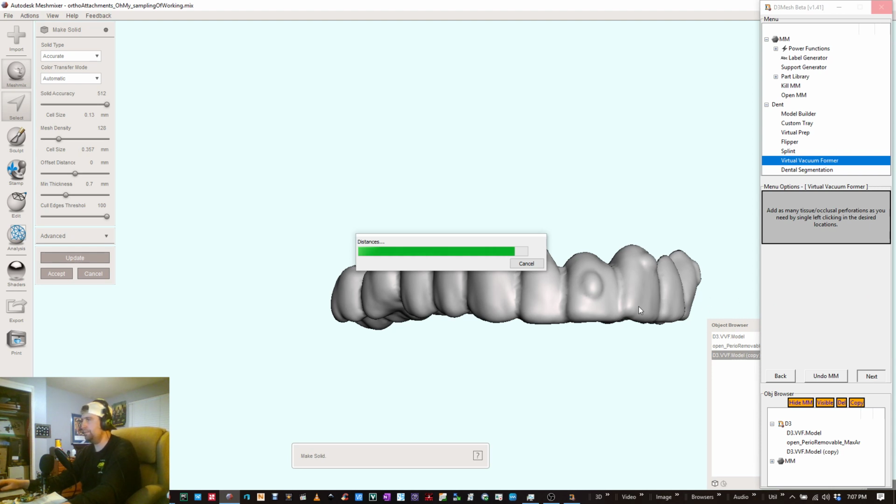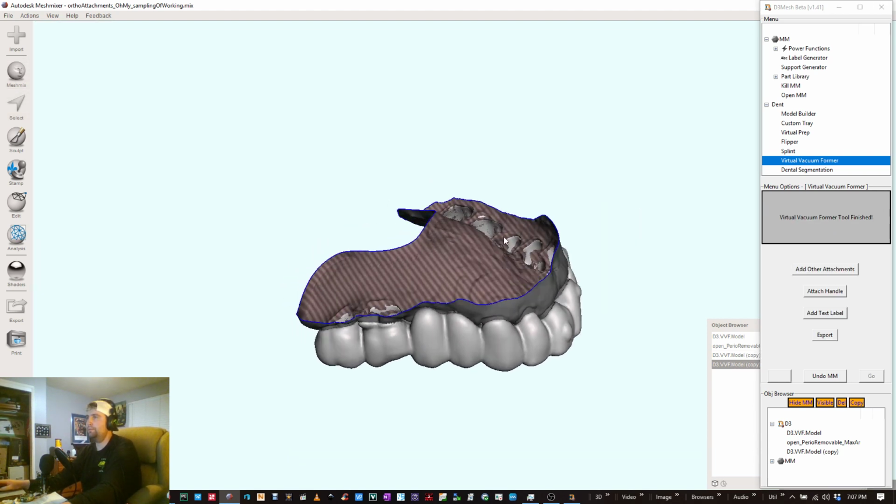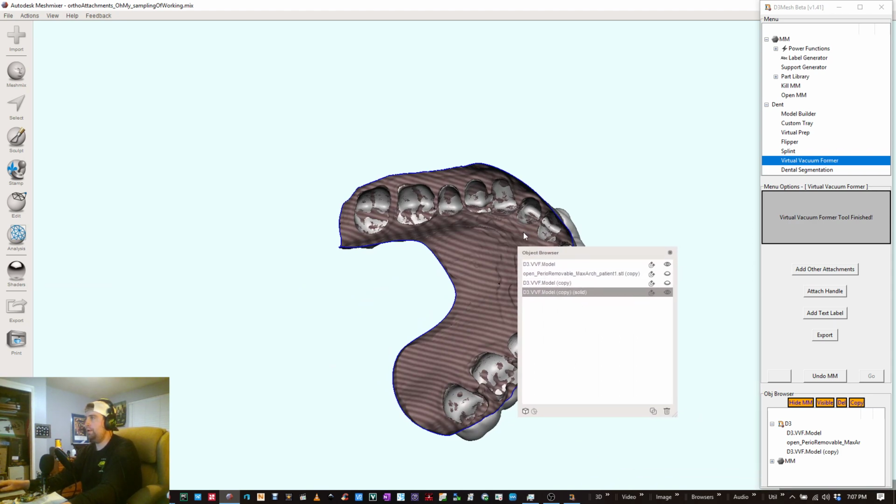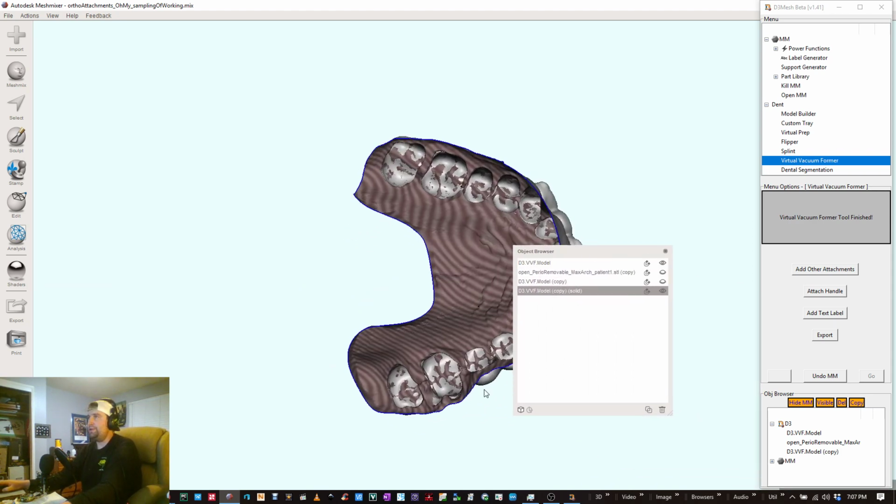Come on. All right, let's see. I mean, this looks good.